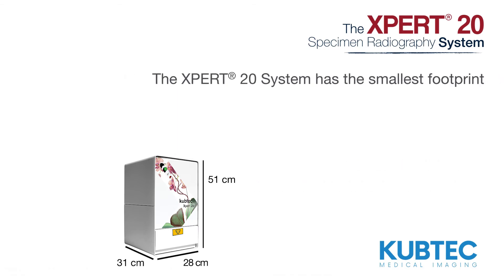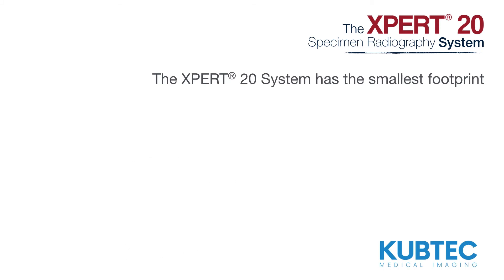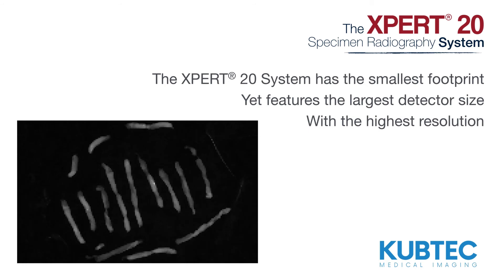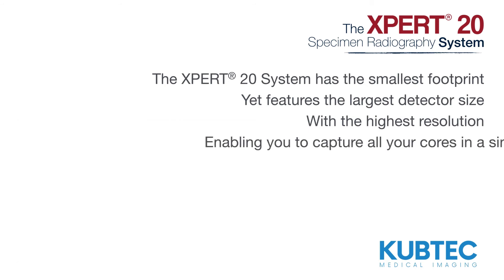The Expert20 system has the smallest footprint, yet features the largest detector size, with the highest resolution, enabling you to capture all your cores in a single image.